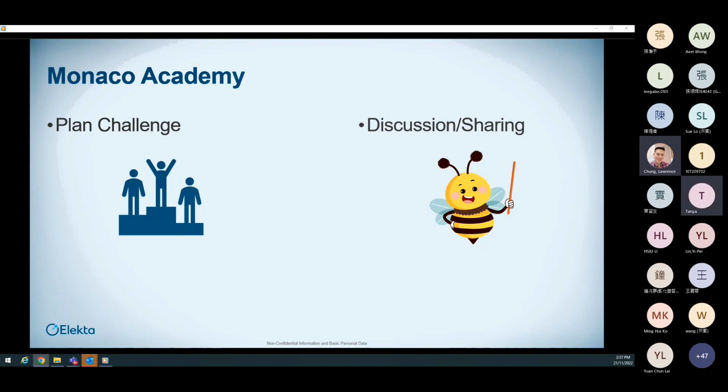No one has access to your score except yourself, and it's a great time for you to go back and, as I said, refine your practice and see how good a score you can get. And then obviously discuss that and collaborate with your colleagues, and then finally, share those successes in the group.